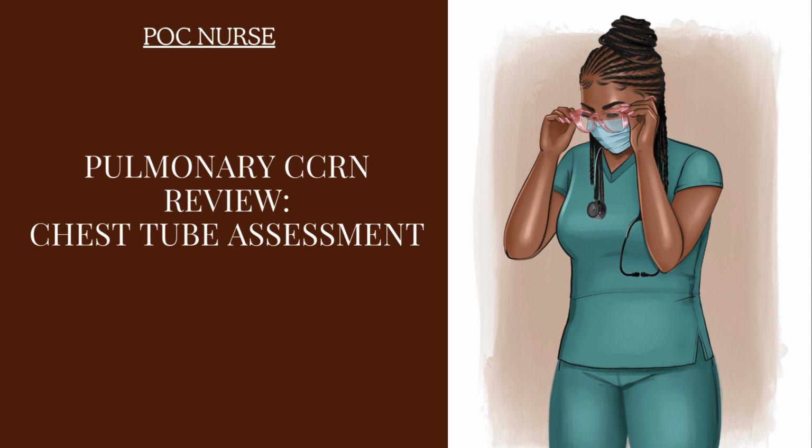Another complication of the chest tube is when the drainage out of the chest tube stops, especially if the chest tube was just placed. So if the patient comes out with a freshly placed chest tube, or the chest tube was placed at bedside, because there's fluid to be drained out, and maybe it was draining fluid out when it was first placed, and then suddenly it's not draining anymore. Maybe on x-ray there is an estimate that the patient has 500 ml of whatever kind of fluid there, and you look at the box, you only have 100, and this thing is not draining.